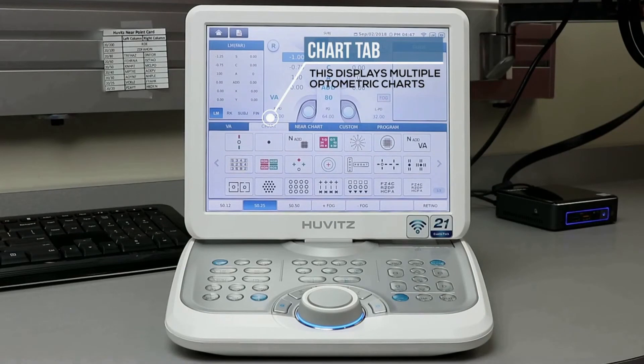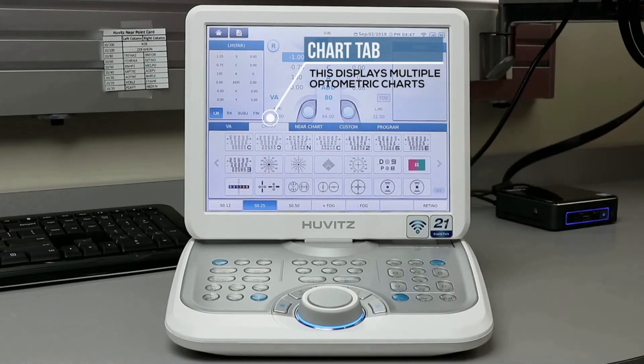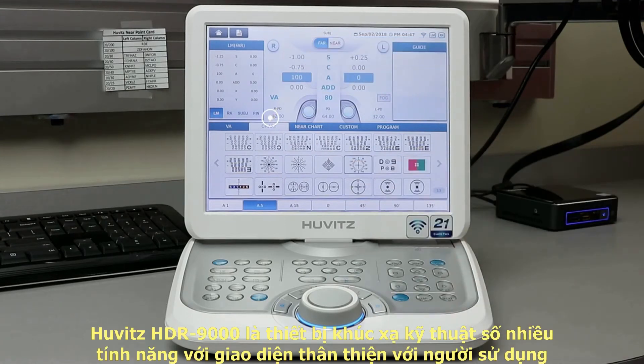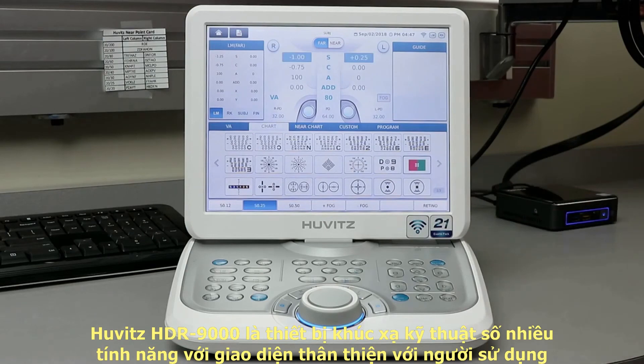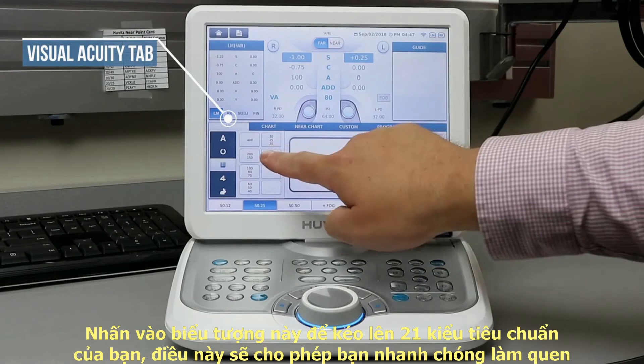In the center, pull up the chart tab to show you the many charts and tests available for you to use. Each button that you press will project directly onto your visual acuity chart. Select the VA tab to go back to your main menu.